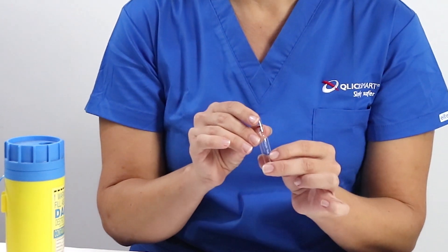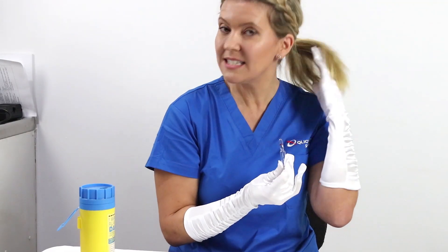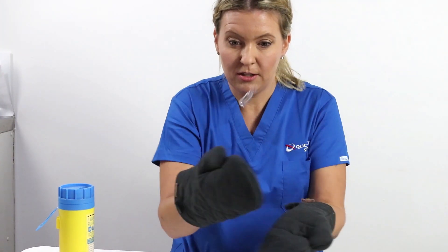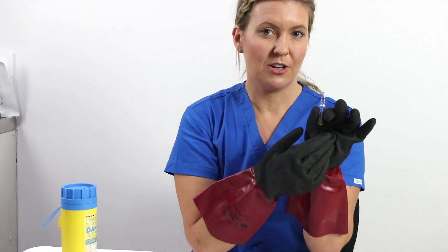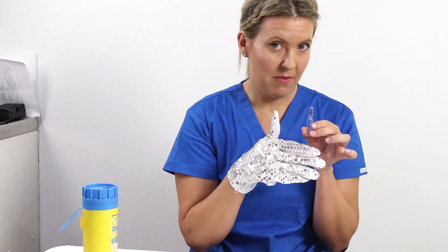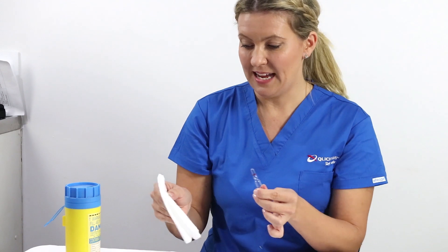Method 1 is the bare hands method. Another method is the princess method. And how about the hot potato method? The cleaner method. You could also try the gardening method, the tough guy method, the Michael Jackson method, the boxing method, and many like to use the paper towel method.